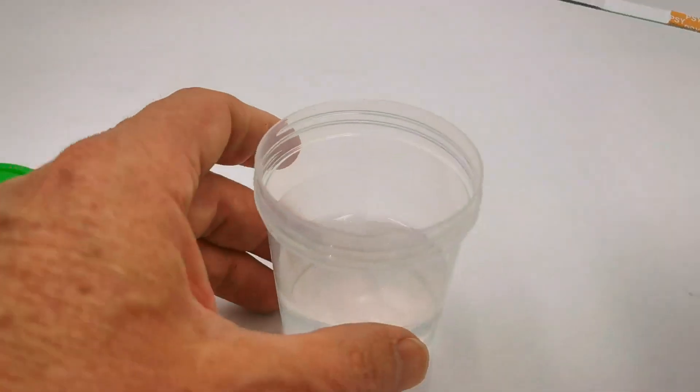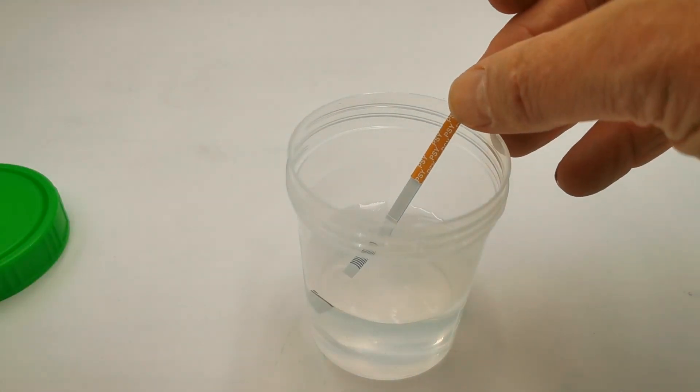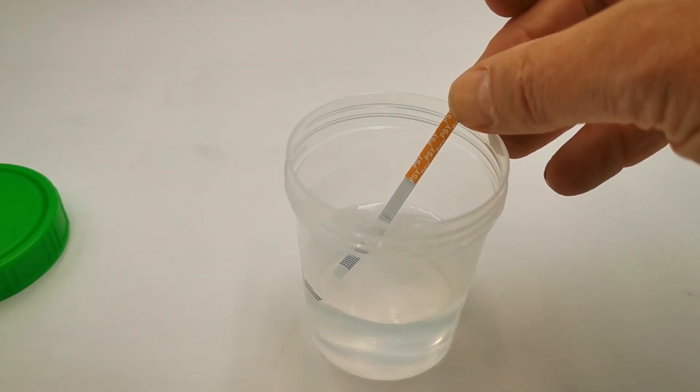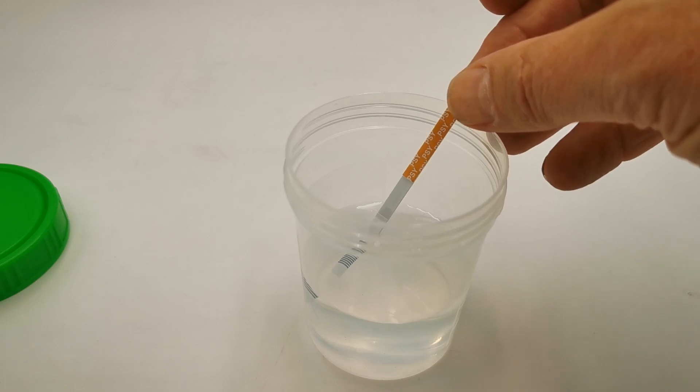Take your fresh urine sample and dip the test strip to the top of the wavy lines, holding it in the sample for around 5 to 10 seconds.